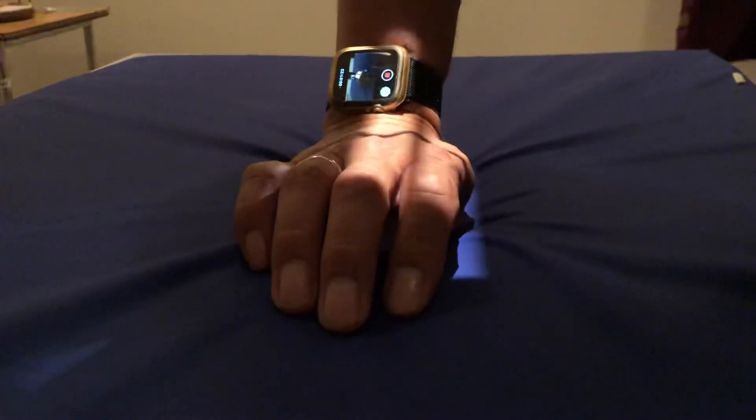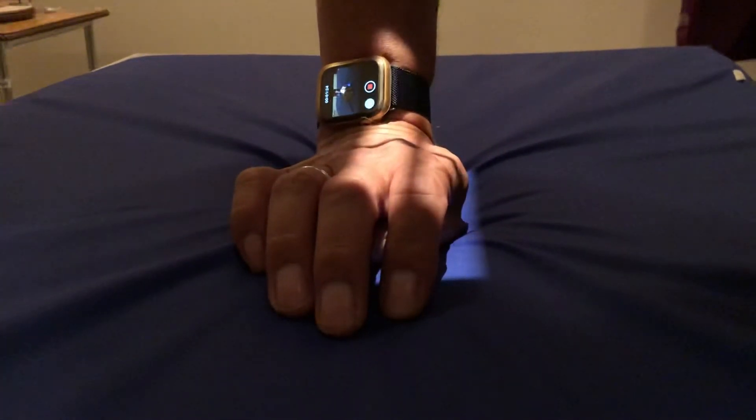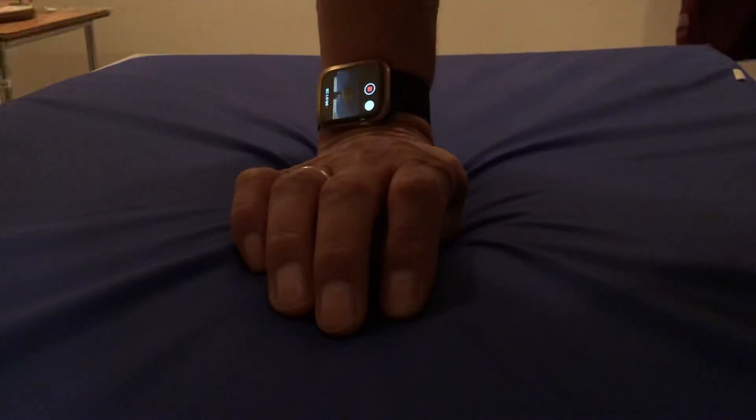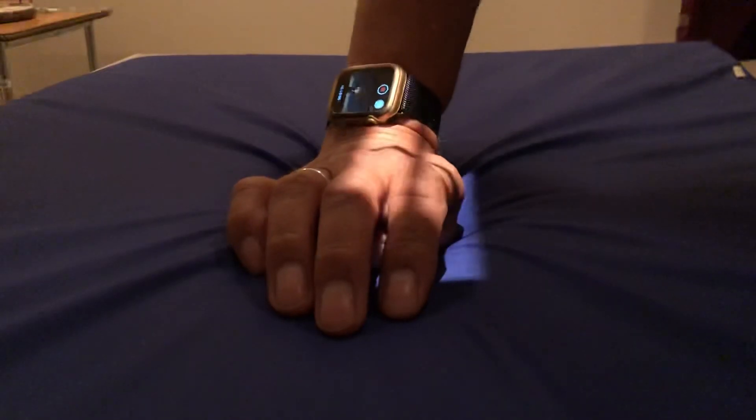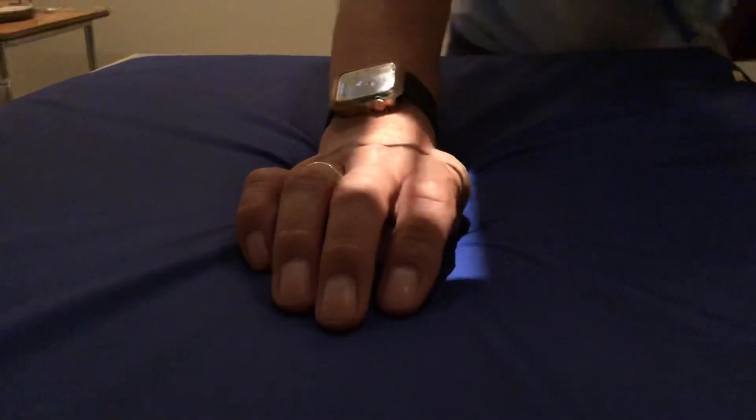And the very last one is going to be the opposite oblique, and the opposite oblique is exactly the same as the first oblique, except instead of having your hand face down, you're going to have it face up or palm up. And so it'll go like this.